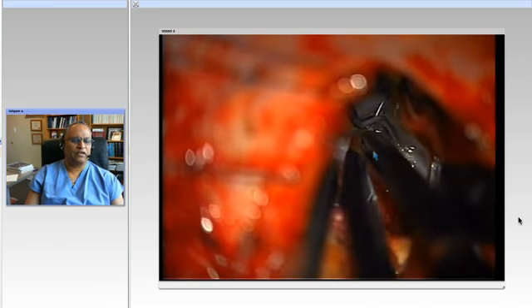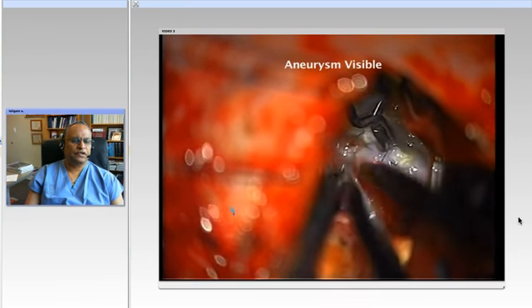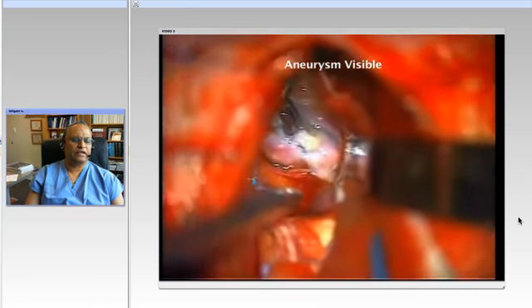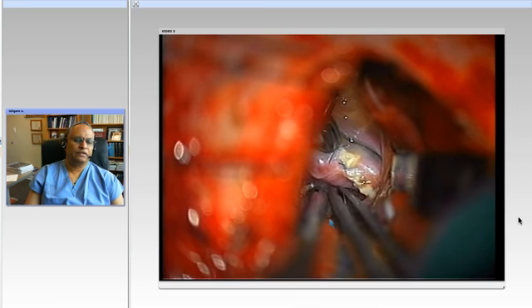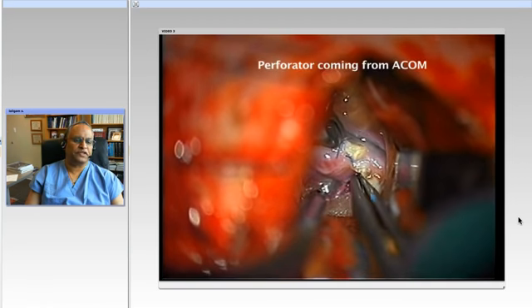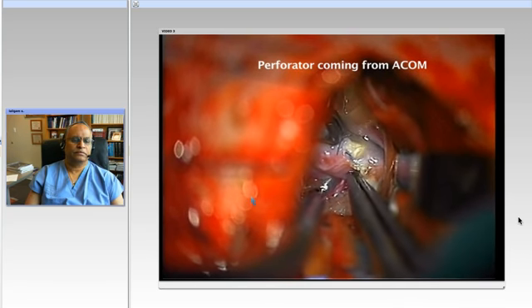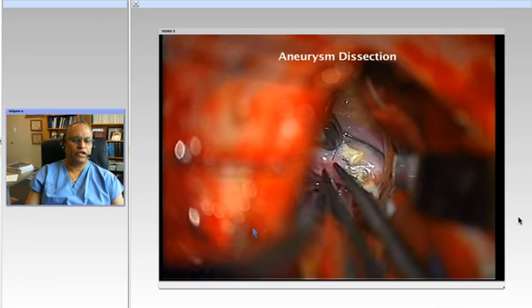And here you can see now the aneurysm that has formed, which is not at the prior repair site, but from the neck, which of course is weak in that area. And here's a perforator. One perforator, actually there were 2 perforators in this region. One, and there's another one there. Here's the left A1.